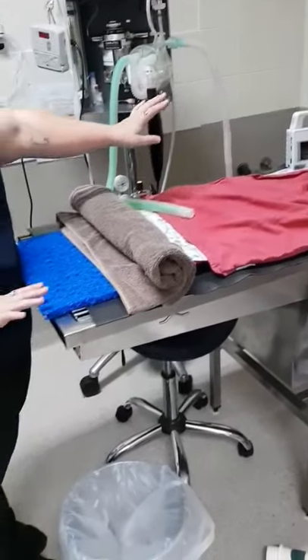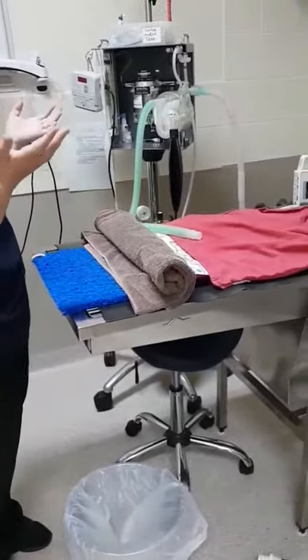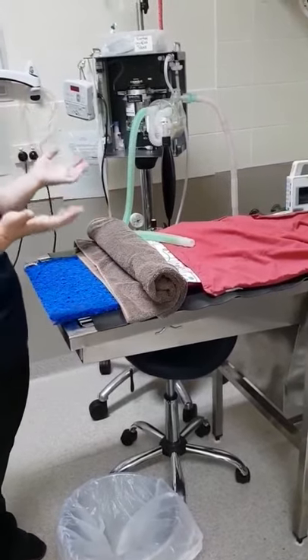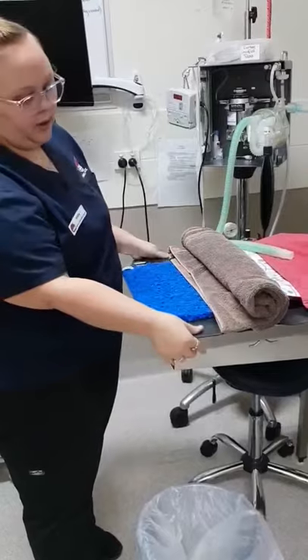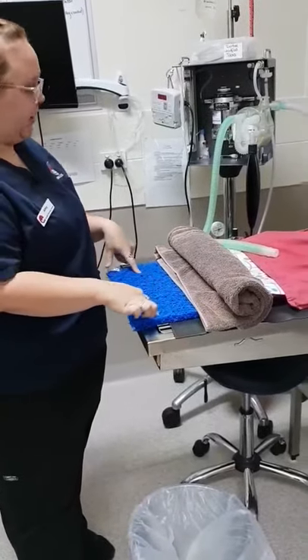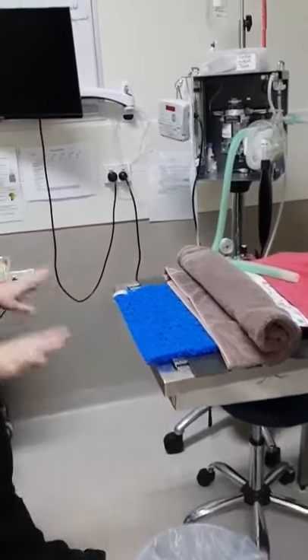We have our dental table set up with our positioning agent, which is a foam that is placed underneath the animal. We have a towel for their neck, our rubber mat underneath it, and the draining mat.